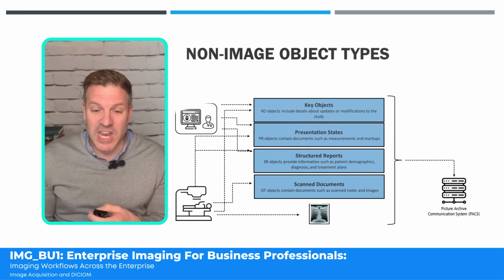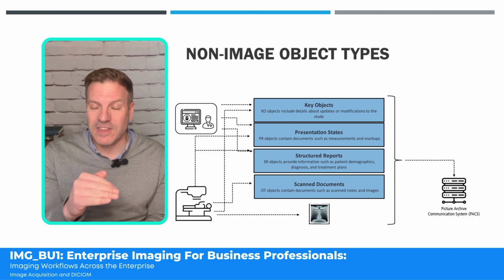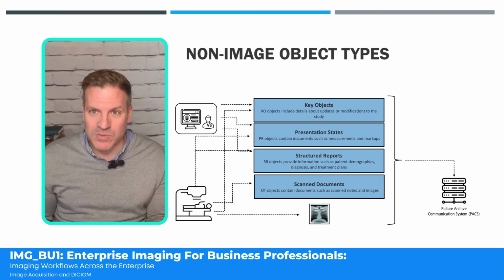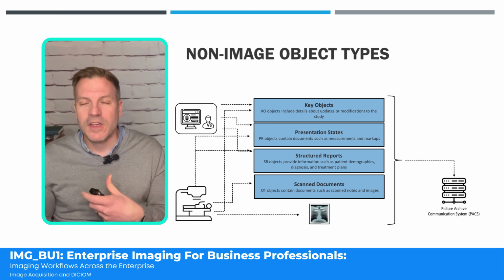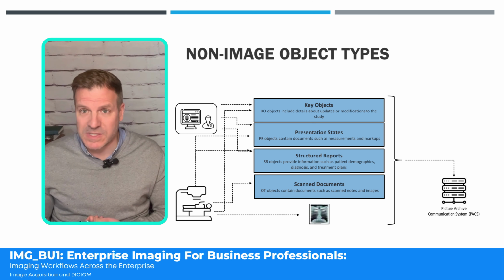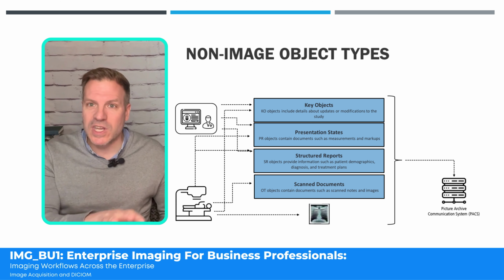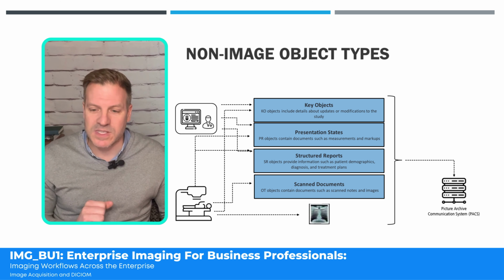And these can be generated by the modality themselves. They can be generated at the clinical workstation, the PACS RIS workstation. But these are a common thing that we'll encounter at that instance level. So most of the time, a study will primarily have the majority of images, but we should expect to see non-image object types as well.